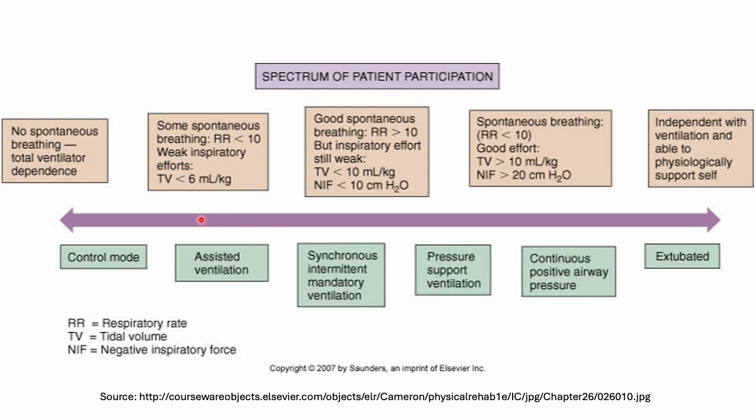Because as I mentioned before, in controlled or assisted ventilation, all breaths are machine breaths. They are not spontaneous breaths. But when the patient is switched to SIMV or on spontaneous modes like PSV, then yes, the breaths can be partially spontaneous in SIMV or 100% spontaneous if they are on PSV or CPAP.